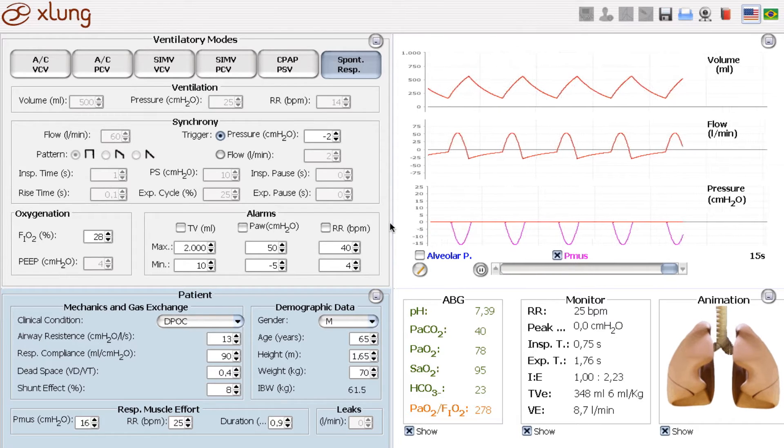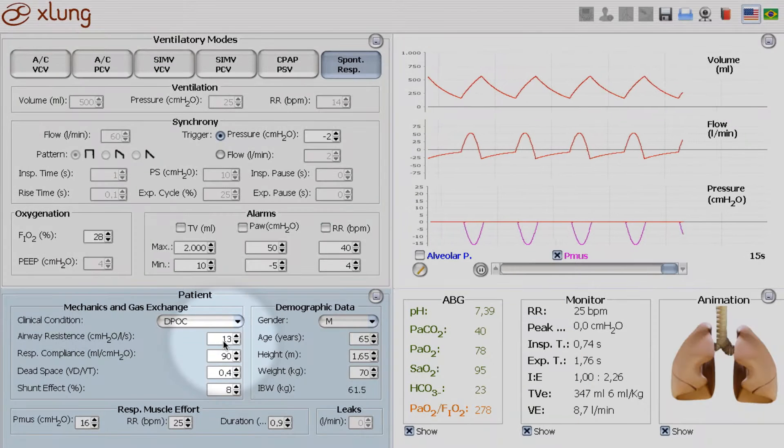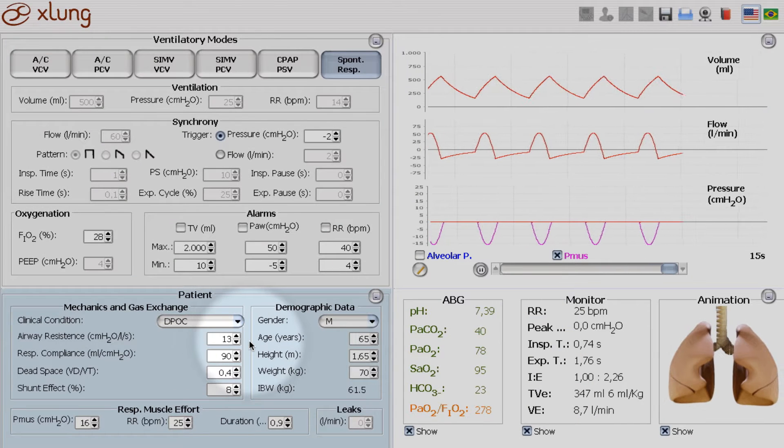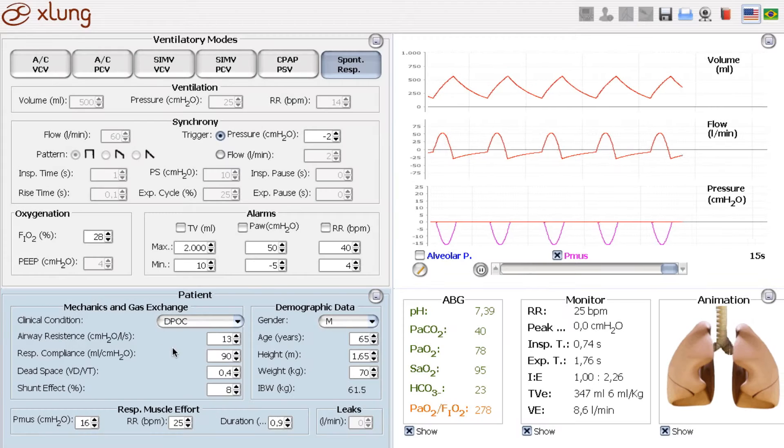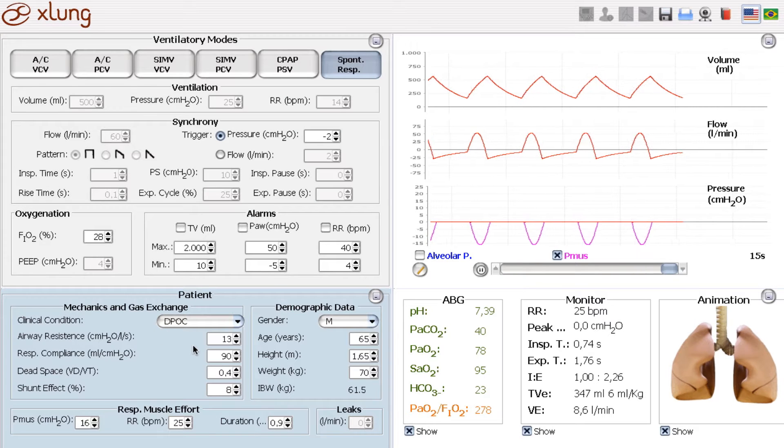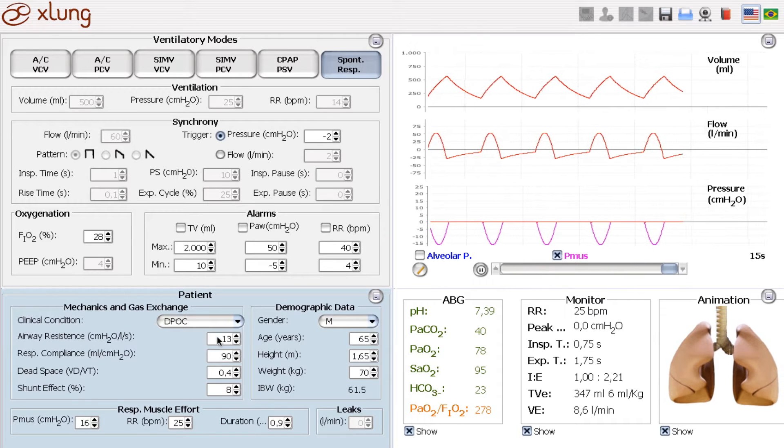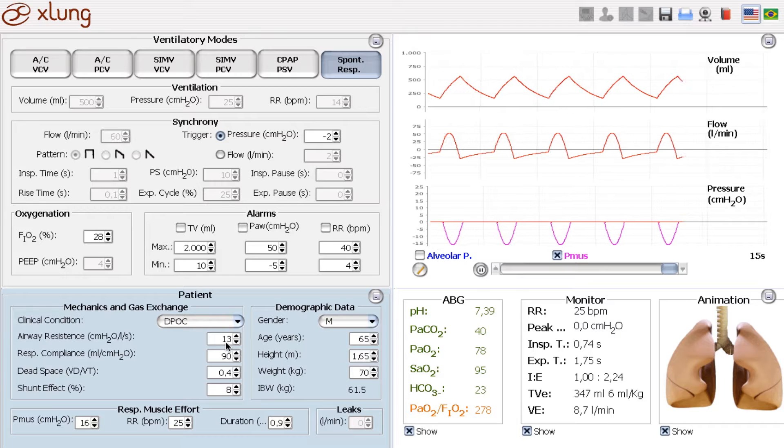So the patient has an increased airway resistance, but for some problem he develops a severe bronchospasm. So let's induce an increment in his airway resistance.